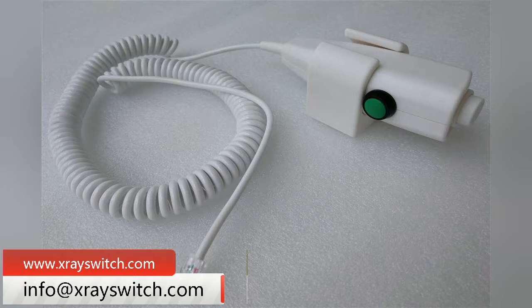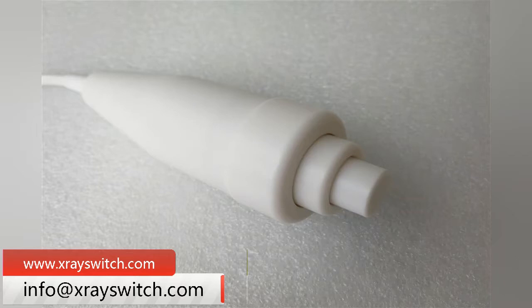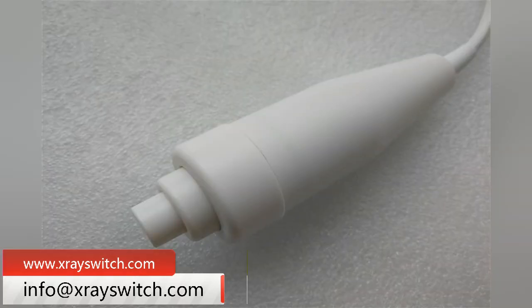The outer skin of these 6 wired x-ray hand switch wires is made of PU material, which is corrosion resistant and has good tensile property, and will not be deformed by long pulling.